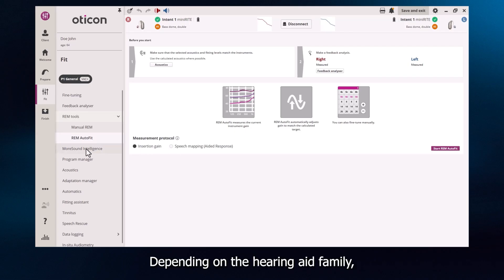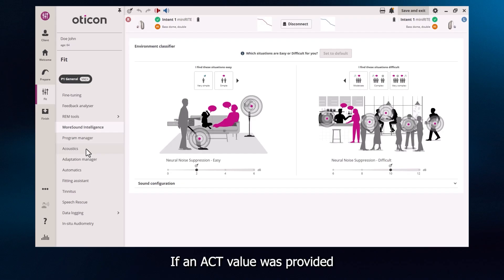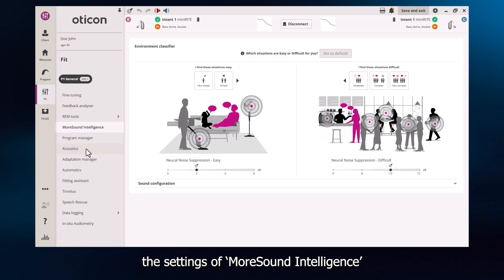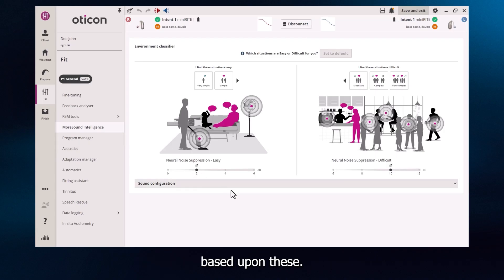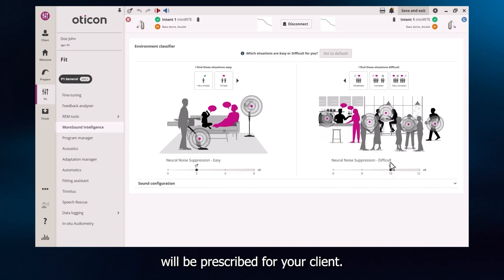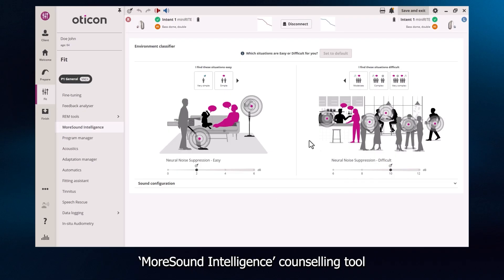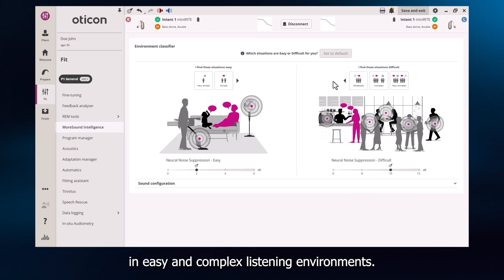Depending on the hearing aid family, More Sound Intelligence is the feature that provides help in noise for your client. If an ACT value was provided, or the personalisation questionnaire was completed, the settings of More Sound Intelligence are tailored to your client based upon these. If not, a default setting will be prescribed. Or, you can optionally use the More Sound Intelligence counselling tool to set the amount of help your client receives in easy and complex listening environments.